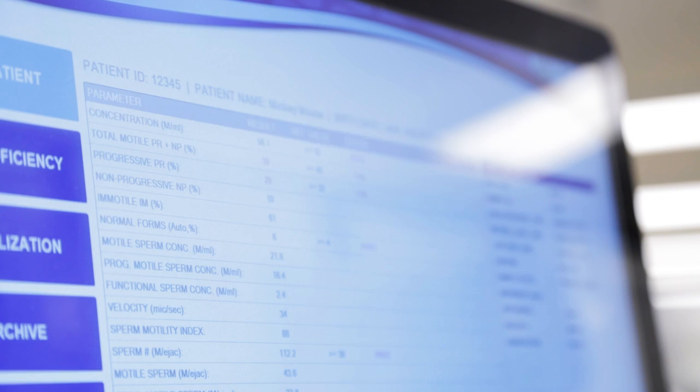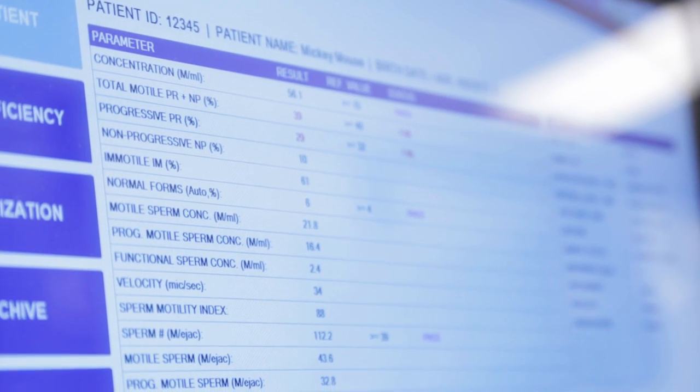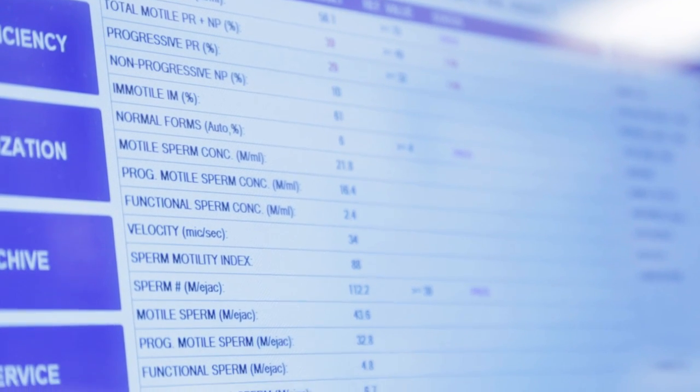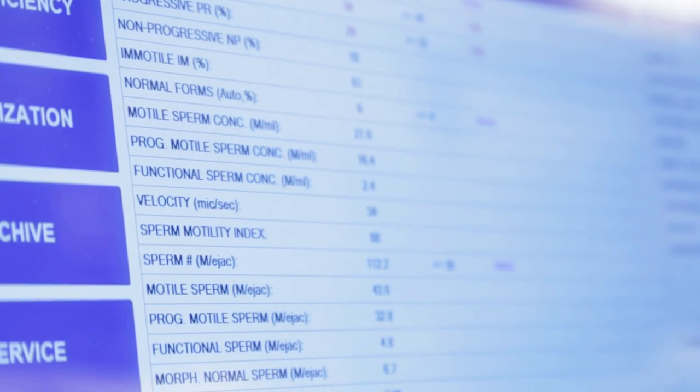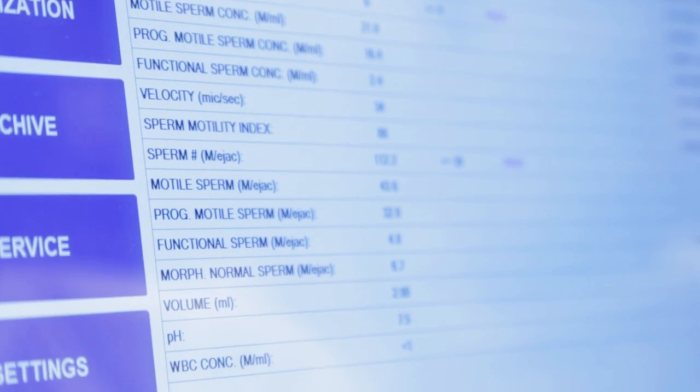Less than 75 seconds later, your test is complete. Fully automated results include sperm concentration, motility, progressive motility, normal morphology, velocity, motile sperm concentration, functional sperm concentration, and much more.